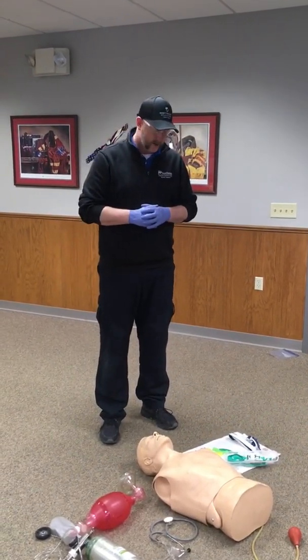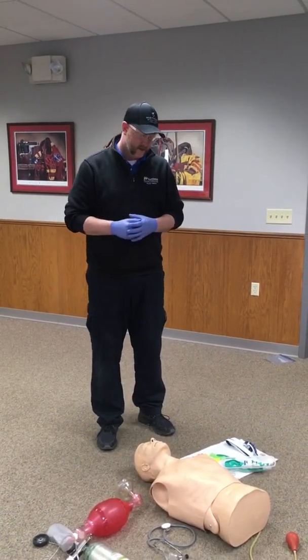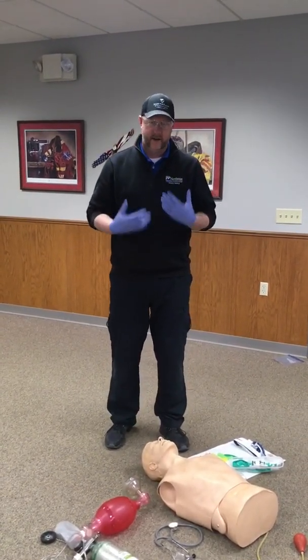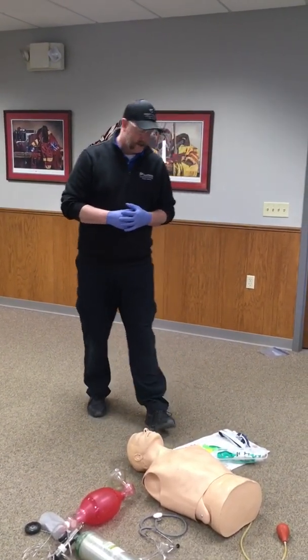It'll be some scenario where you have a male patient who is apneic but has a pulse. There may be some additional scenario around it, but what we're concerned about is that they're not breathing but they still have a pulse, and the scene is safe for you to go in.